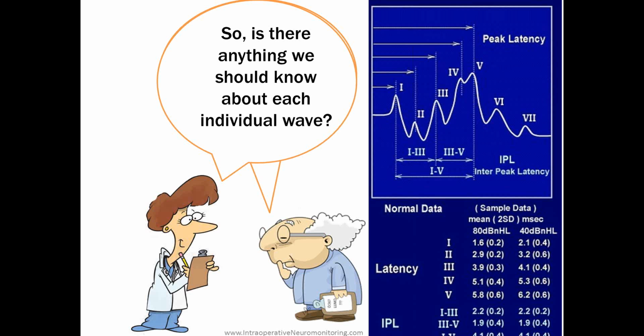So is there anything we should know about each individual wave? We're going to break down each wave to know where the generator is, what the vascular supply is, and if we're having trouble recording it, what are some technical moves we can use.